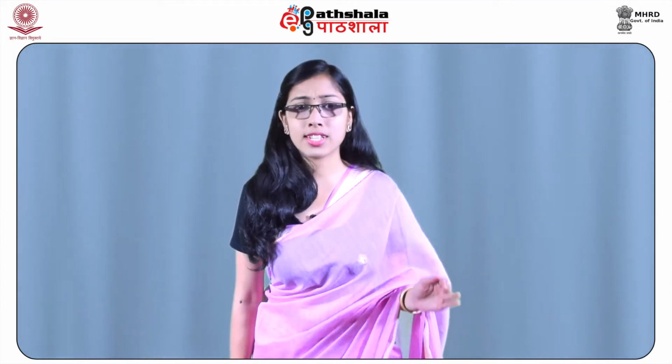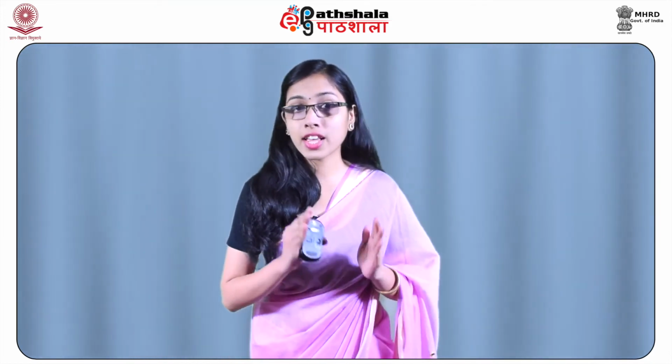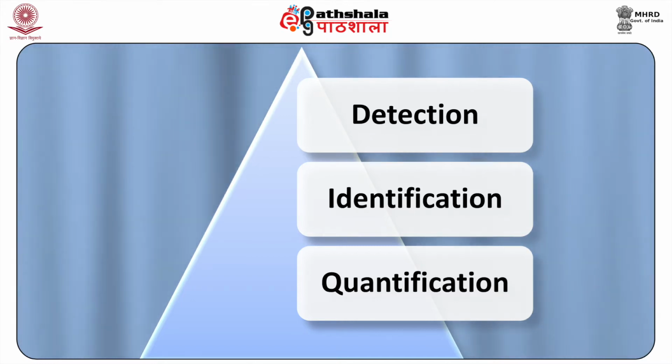Choosing the best extraction procedure for a particular case and, when necessary, developing a new extraction method or technique that correctly addresses specific case challenges are very essential skills of the analytical toxicologist. The isolation of the compounds of concern from the biological matrix or the biological specimen is essential for their successful detection, identification and quantification as well.